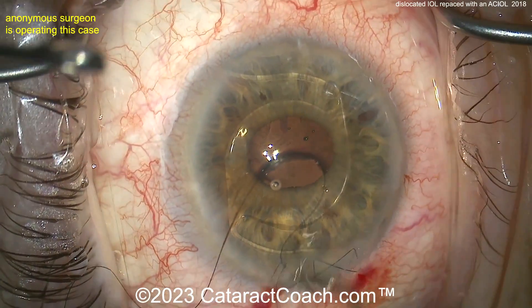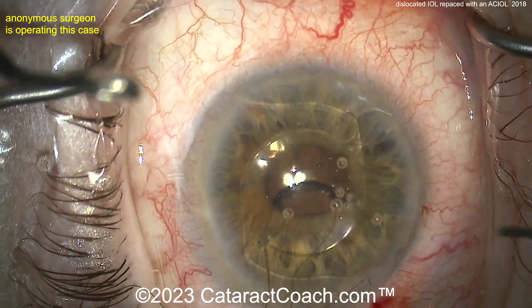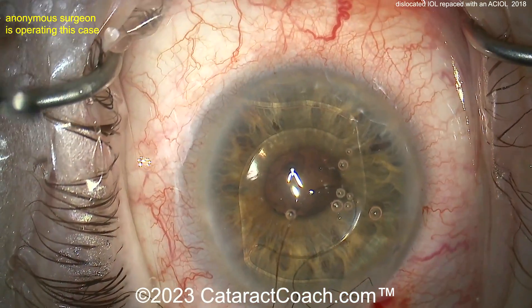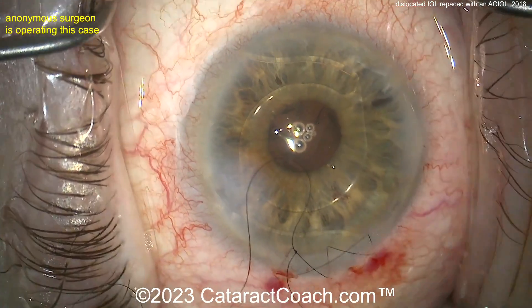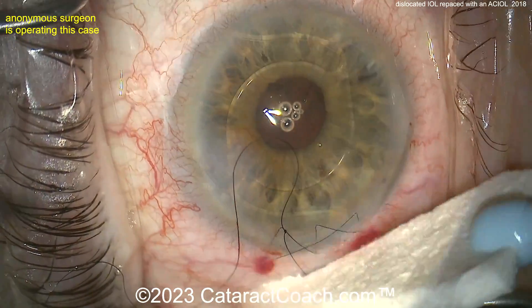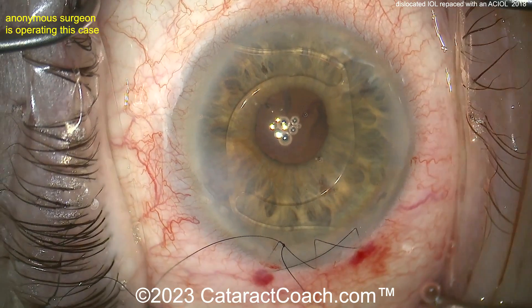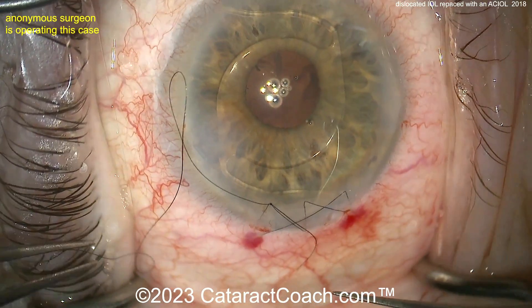That triamcinolone would have helped confirm there's no prolapsed vitreous. Suturing up that corneal incision — a large incision like that on the cornea, such an avascular tissue, is just going to have less than optimal healing. You may want to leave those sutures in for a long time. The tunnel length of the incision is sufficiently long, so suturing it will produce a mild degree of astigmatic effect. That suture looks pretty good — tie the ends down and get that knot buried.